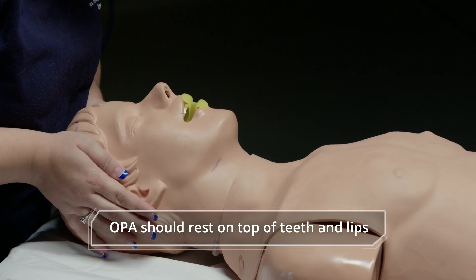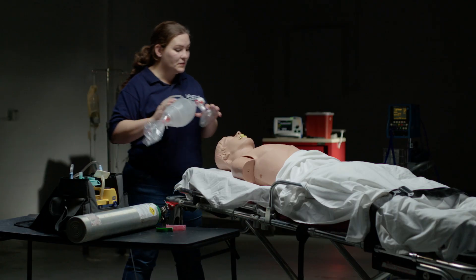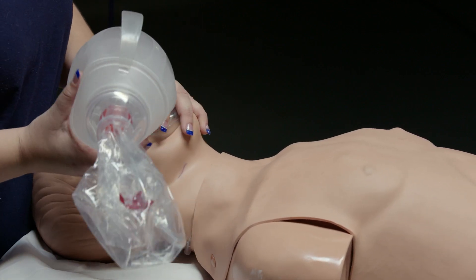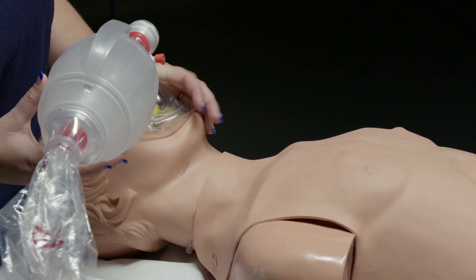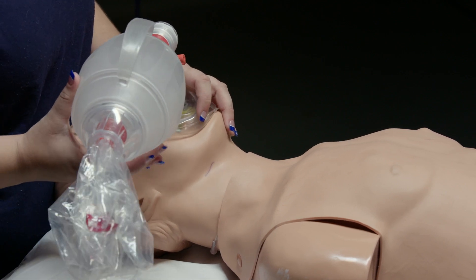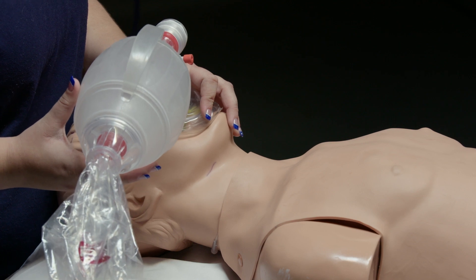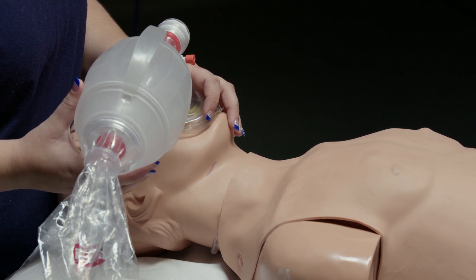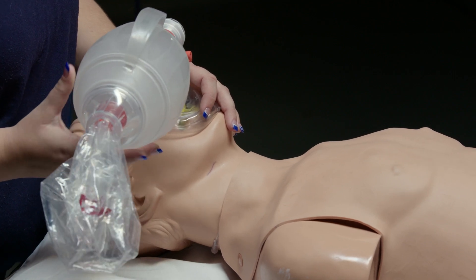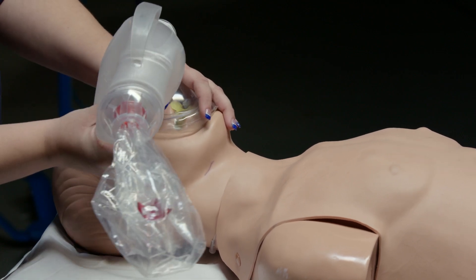No gag reflex is present and the patient accepts the airway adjunct. I'm going to begin ventilations with the bag valve mask. Ventilations are being performed properly without difficulty. I'm going to recheck a pulse.